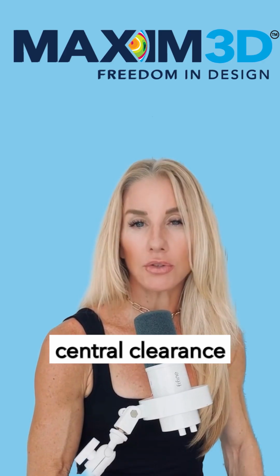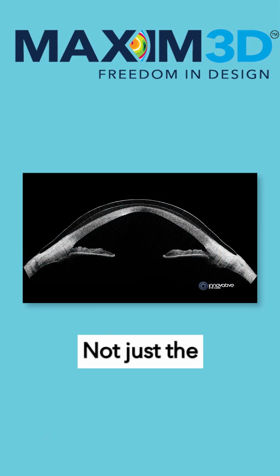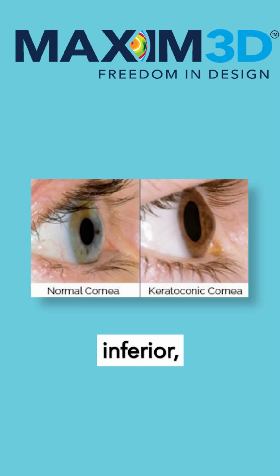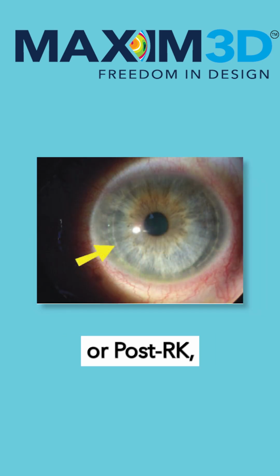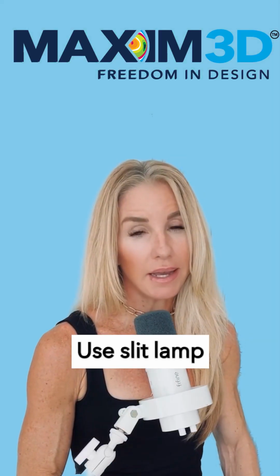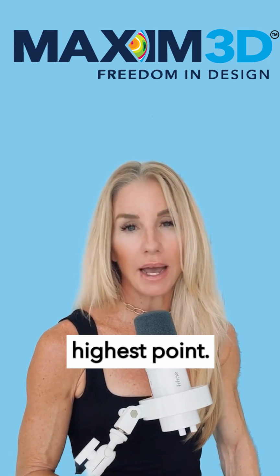But remember, central clearance means measuring over the highest sagittal elevation, not just the geometric center. In keratoconus, the apex is often central or slightly inferior, so evaluate directly over the cone. In post-LASIK or post-RK, the mid-peripheral cornea may be the peak, so assess accordingly. Use slit lamp optic section or an OCT to assess vault over that highest point.